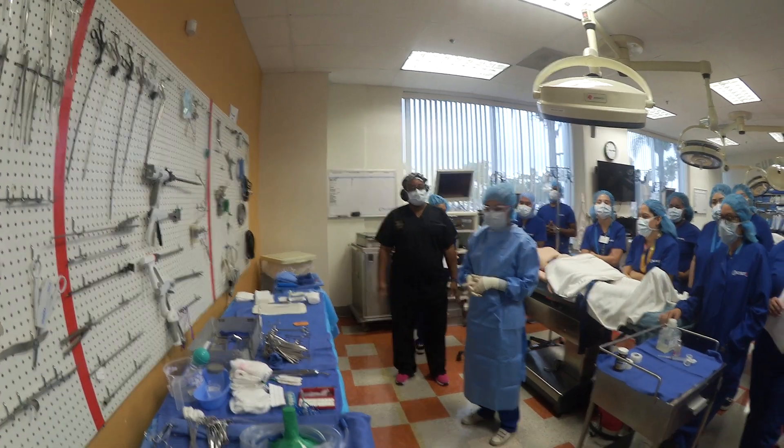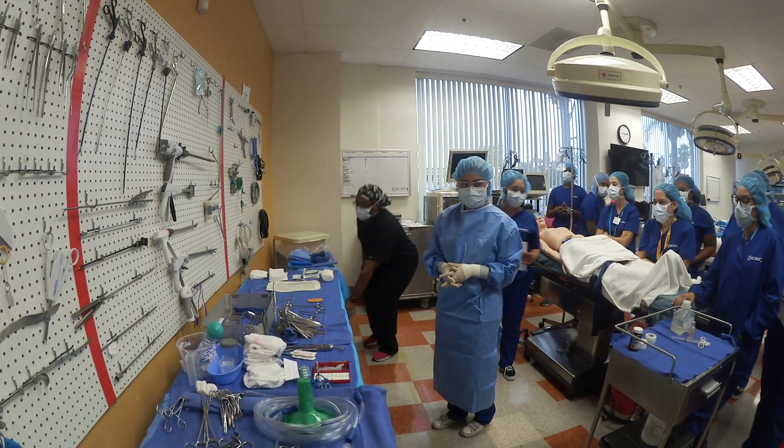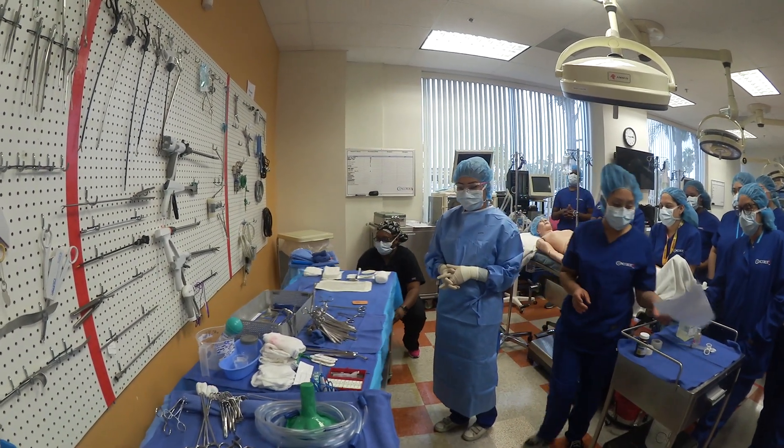Okay. Organized sutures, cutting suture, passing free ties. Number one: organized sutures on back table.